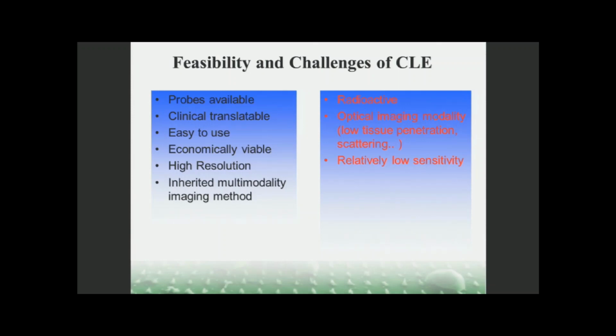The biggest advantage of Cerenkov Luminescence Imaging is that there are lots of probes available, like many already labeled compounds that have been tried in our community, and many of them were already approved by the FDA, so they can be quickly tested in the clinic. And CLI or CLE system is also very easy to use. They're very cheap and have very high resolution. And especially, this imaging modality is an inherently multimodality imaging method.